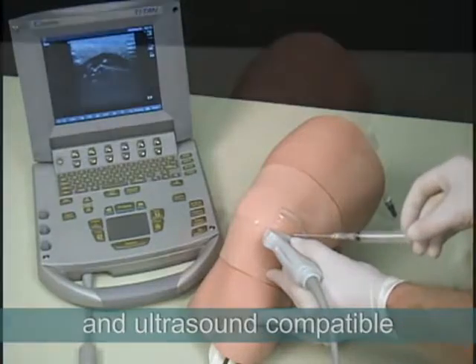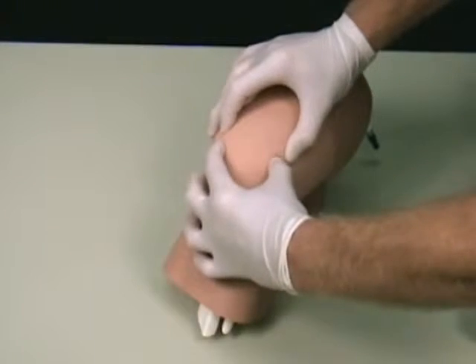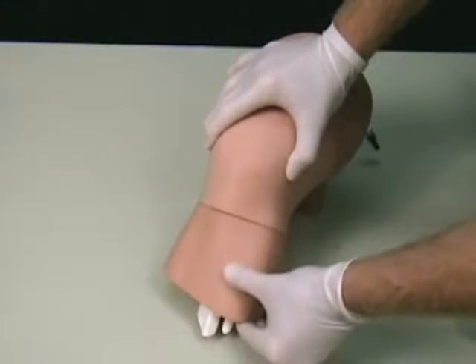The ultrasound-compatible model represents an extended left leg and includes the patella, patella ligament, tibia, fibula, femur, synovial sac, and synovial fluid.